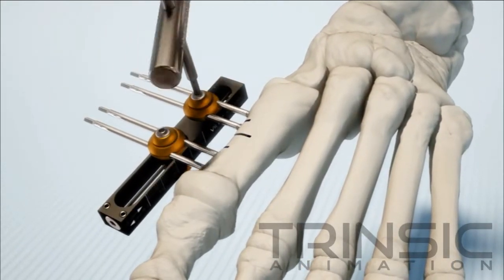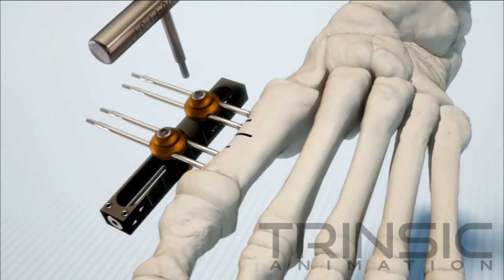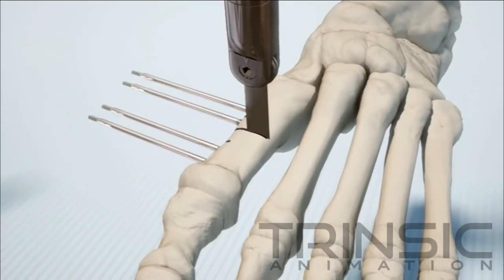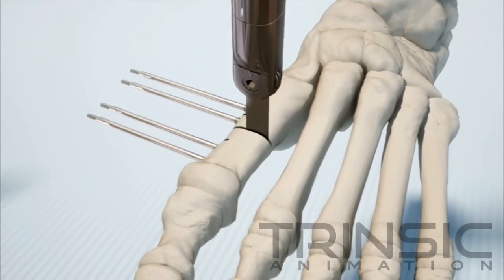Next, loosen the clamps enough to remove the mini rail while leaving the pins in place. Make a small incision and expose the bone. Mark the osteotomy location.